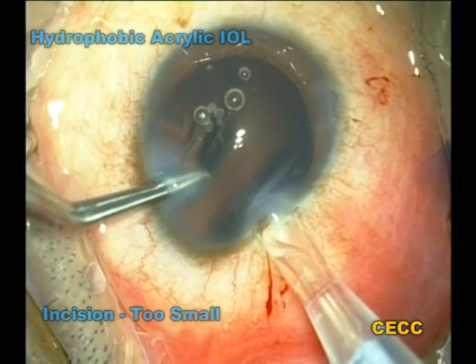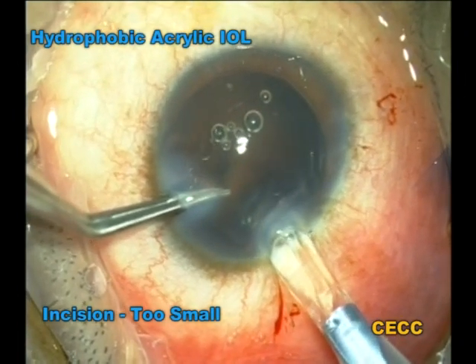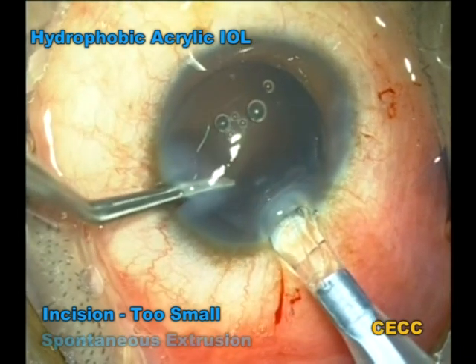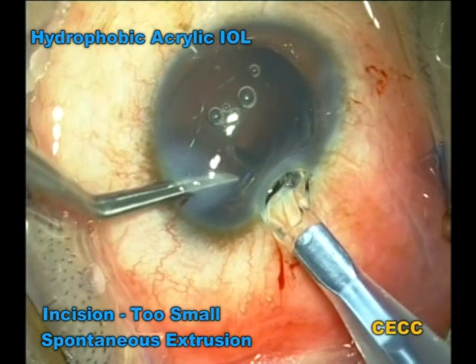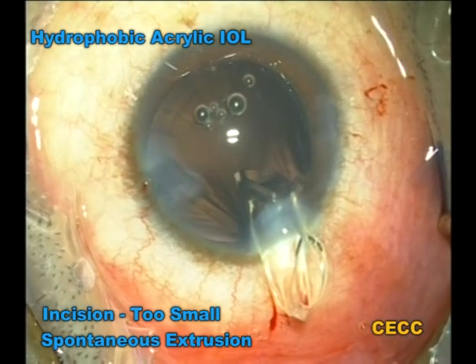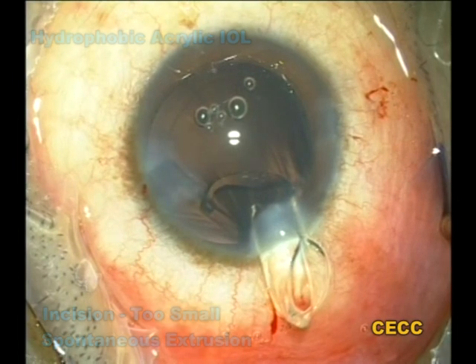This was a patient who had undergone biaxial microincision cataract surgery. The corneal incision enlarged to 1.8 mm post cataract removal. An initial unsuccessful attempt was made to insert a single-piece hydrophobic intraocular lens through this incision. The incision finally had to be enlarged to 2 mm, which is the recommended minimal incision size for this lens.